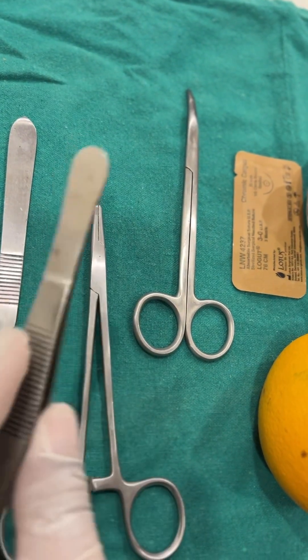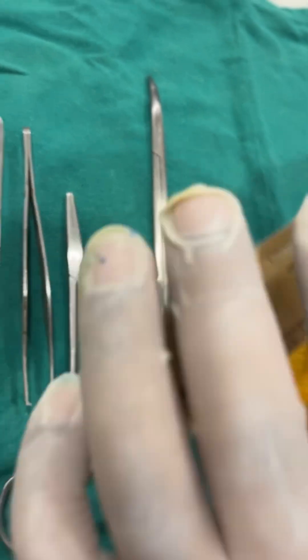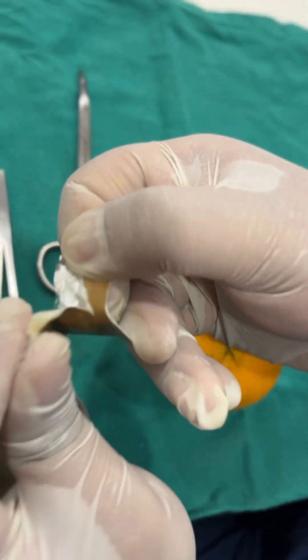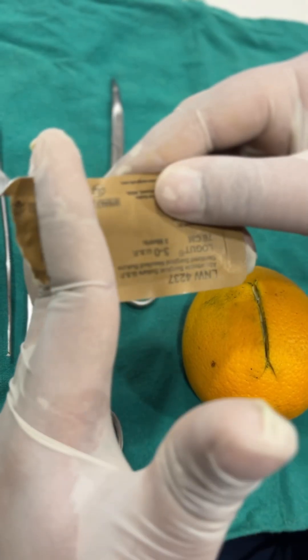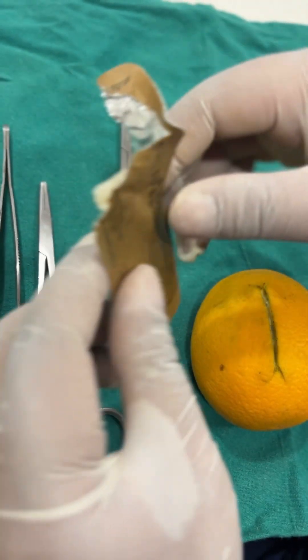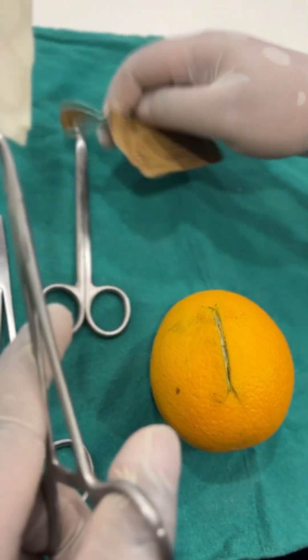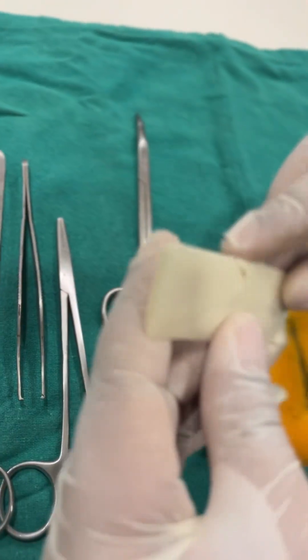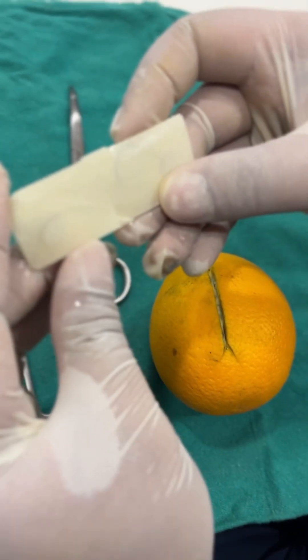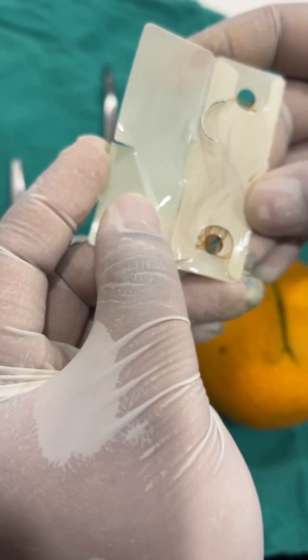We will also need an Adson forcep to hold the flap. Now let us see how to open this suture. We see there is a slit over here — what we have to do is tear along the slit. Never ever cut it because you would end up cutting the entire suture. Always tear it along the margins and take it out safely. Here we see an oblique cut and one vertical cut; the vertical cut is where the needle is. We open it up and find the needle.